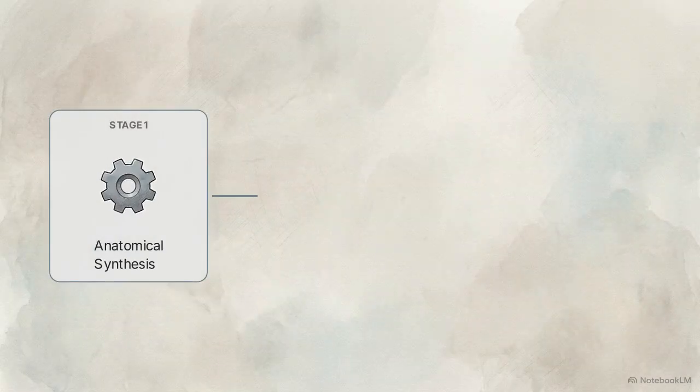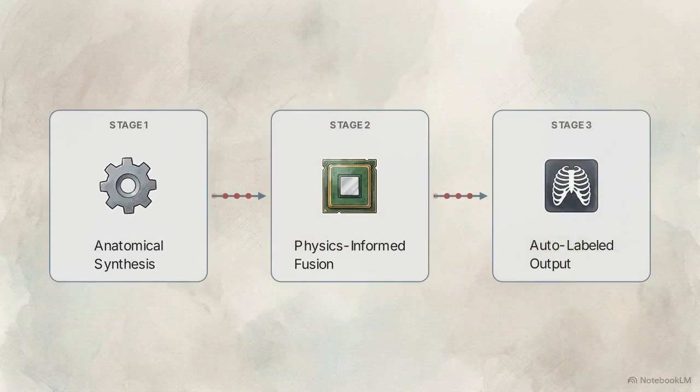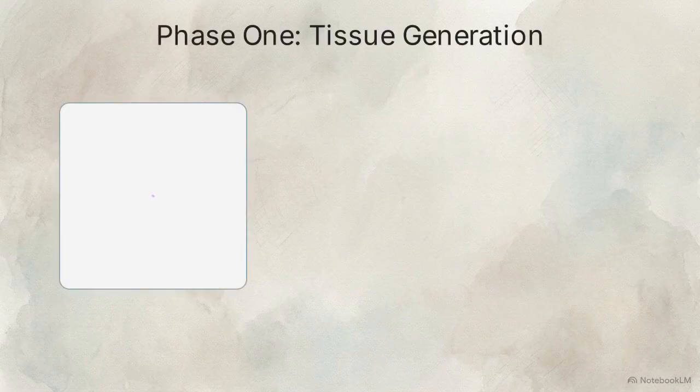It is an end-to-end synthetic pipeline that generates entirely artificial, automatically labeled, and heavily randomized X-ray training data. Solving the perception problem requires mathematically generating the surgical environment from scratch, rather than attempting to film it. Training MicroSyn-X requires generating a realistic physiological background.